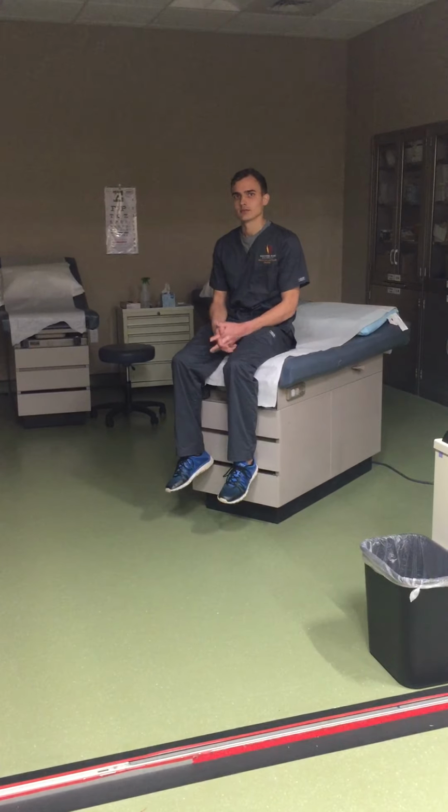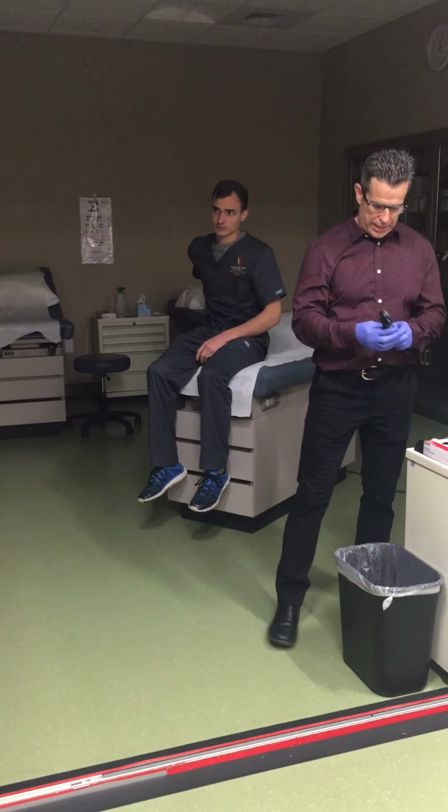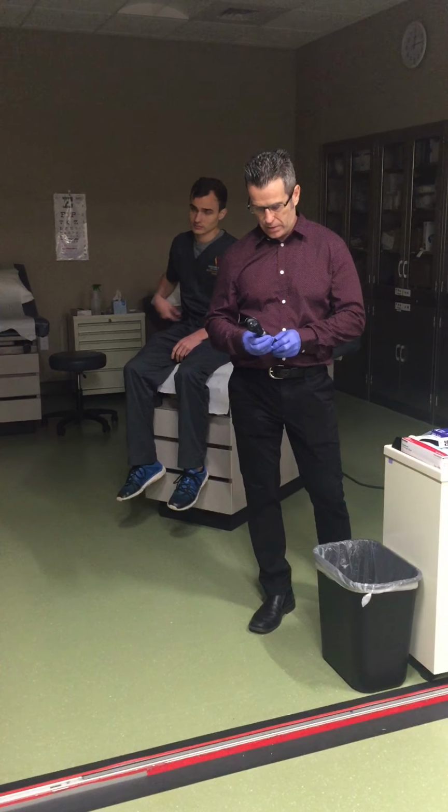Okay? And so in just a minute, Austin or Sid, I'll have you turn the light off, but just wait a second. So how do you work your fundoscope? So the number one thing you do is you want to turn it on.